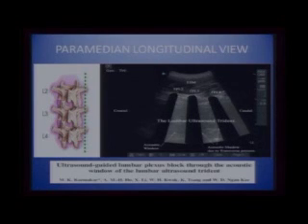So Manoj Karmakar has likened these three acoustic shadows to a lumbar ultrasound trident. If you go back to the trident that Lord Shiva uses, or the trident, if you are alluding to Greek literature, of Poseidon.